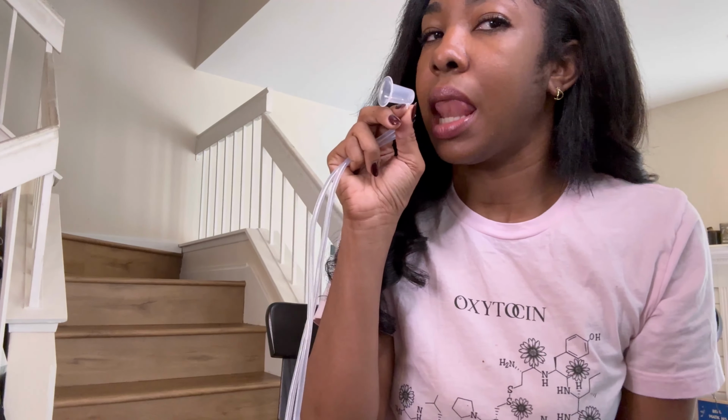It comes with a size small, medium, large. Here they are all together. So we take our tubing and attach it to our little suction cup. Now let's get ready to see how it works.